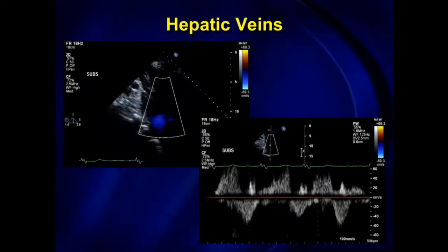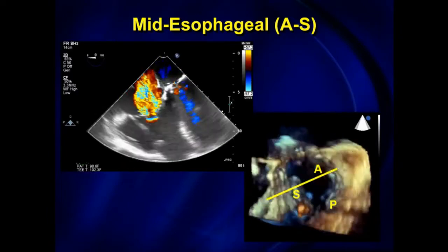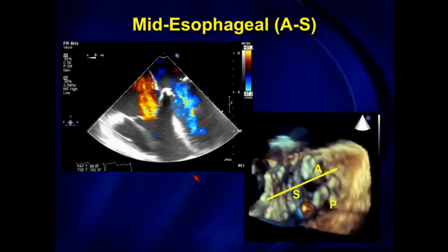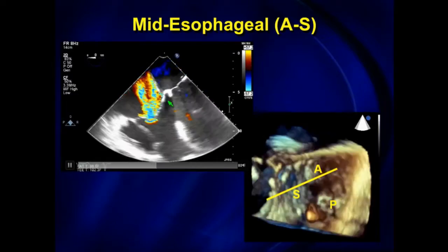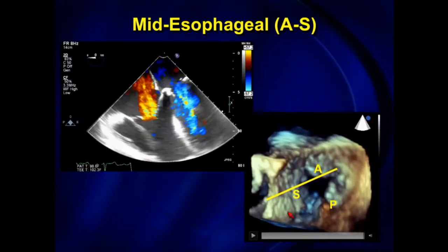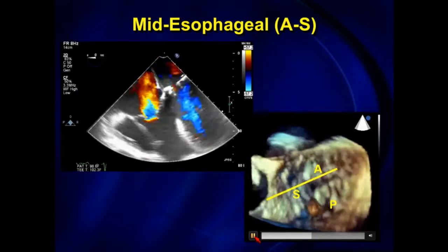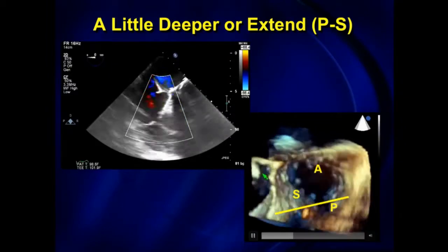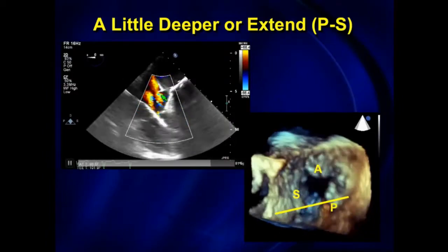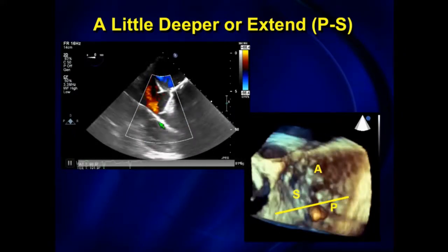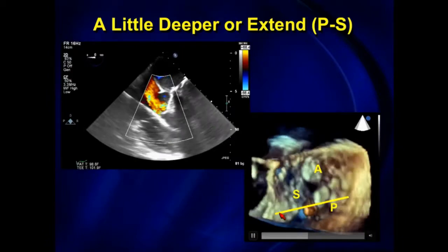Always image the hepatic veins to document reversals there. Now for transesophageal imaging — these two images are from the same patient for correlation. Similar to the transthoracic four-chamber view, if you see the LV opened up and the mitral valve, we should see the anterior and septal leaflets. We have anatomic correlation because in the commissure between the septal and posterior leaflets we see a pacemaker lead. If you advance the probe a little deeper, like the transthoracic view, once you start seeing a little bit of coronary sinus without much mitral valve or LV, we're seeing the septal and posterior leaflets.